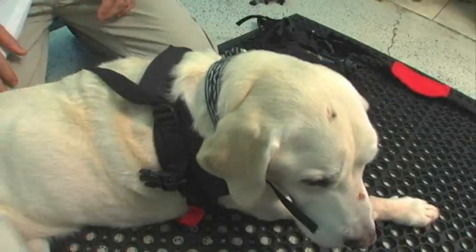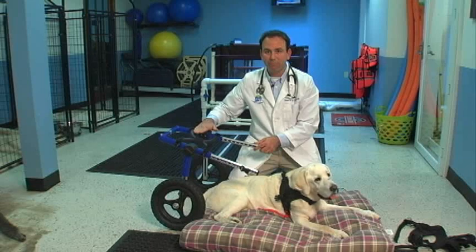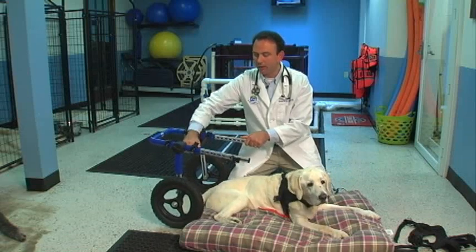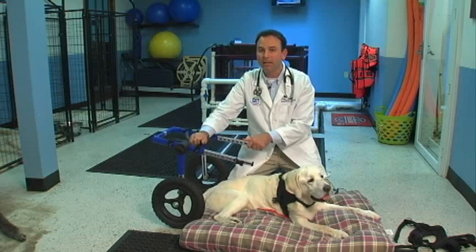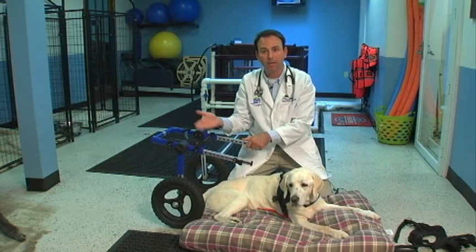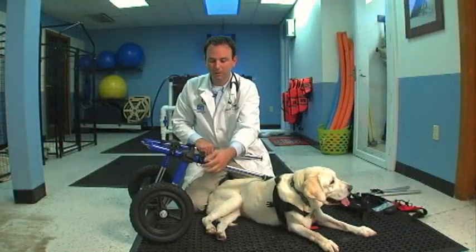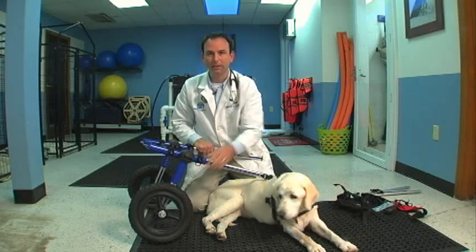Okay? Now that you've gotten your cart together, you want to make sure that the leg rings are completely flush with the sidebars of the cart. Therefore, you've got to make sure that these straps are good and tight, so that this is as tight and secure as it can be on the top. A lot of times, eventually, you'll adjust these in order to drop your dog down so they can put a little more weight on their legs as they begin to improve. But we want to start at the top with the most security. One other thing to remember is that the leg ring, the strap and the buckle, come over the top of the sidebar like that and snap in.